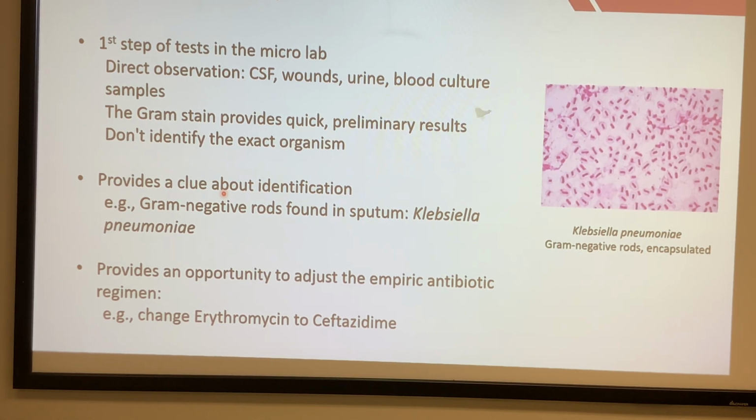So we can see what type of bacteria it is. So do I hear no? You said yes, right? So there's a lot of bacteria. Yes, it's too many. It's all kinds of crap in there. So basically we don't really do it, because it's useless information. We probably can see the constituent organisms, but still it's a lot of interference.